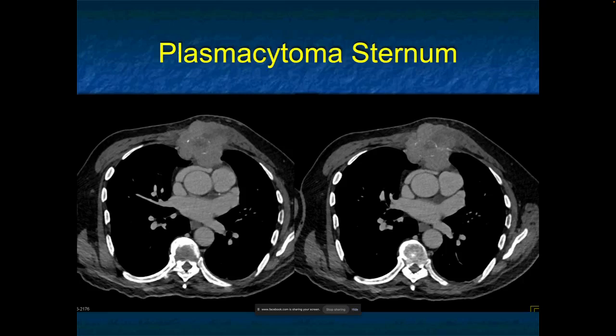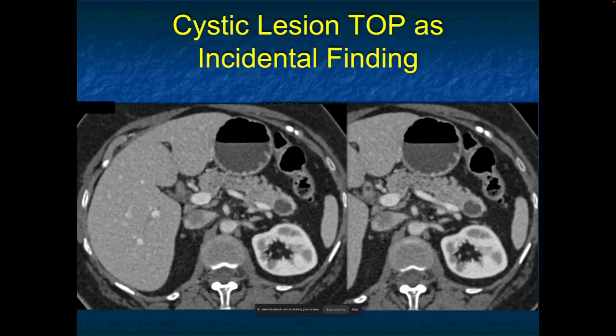I also showed a third case in conference, which was Takayasu's aortitis, where the patient had thickening of the mesenteric vessels, thickening of the branch vessels off the arch, but presented with chest pain. So again, you've got to keep your mind open when you're looking at these cases.